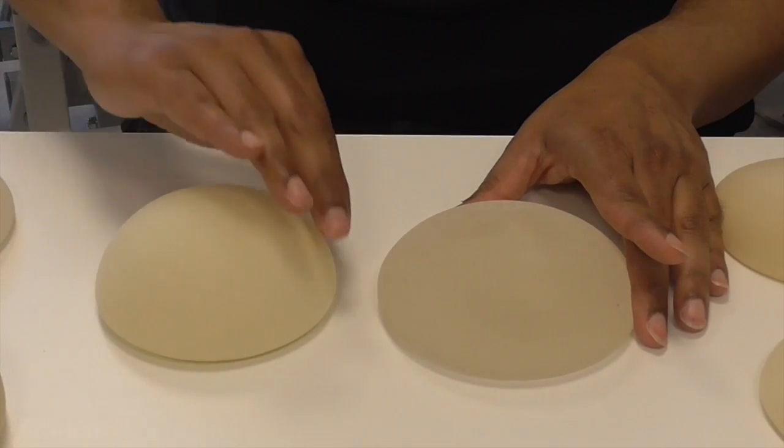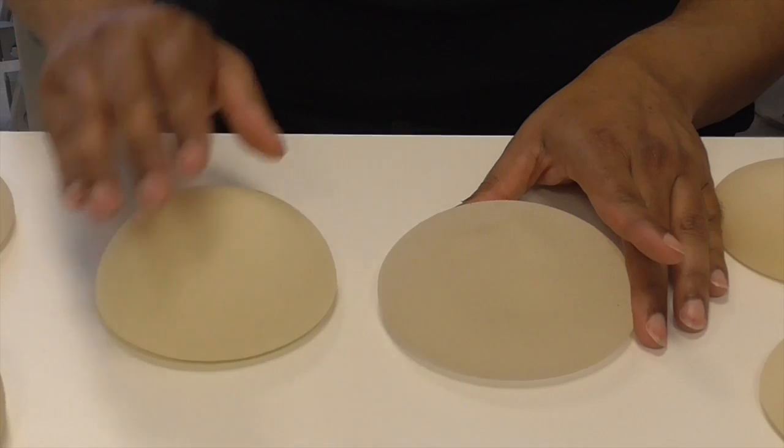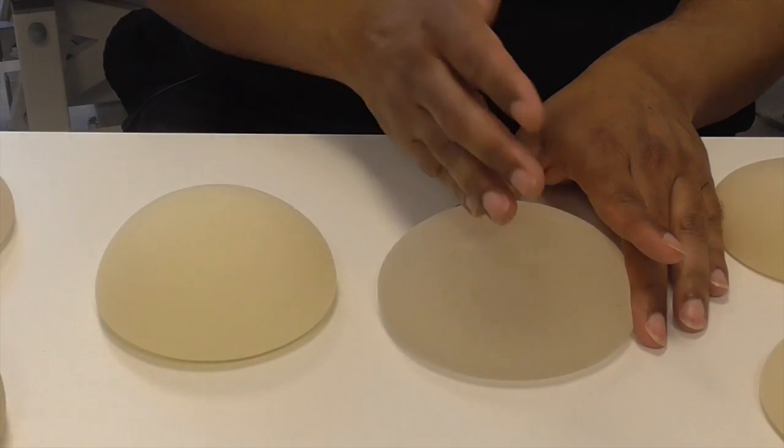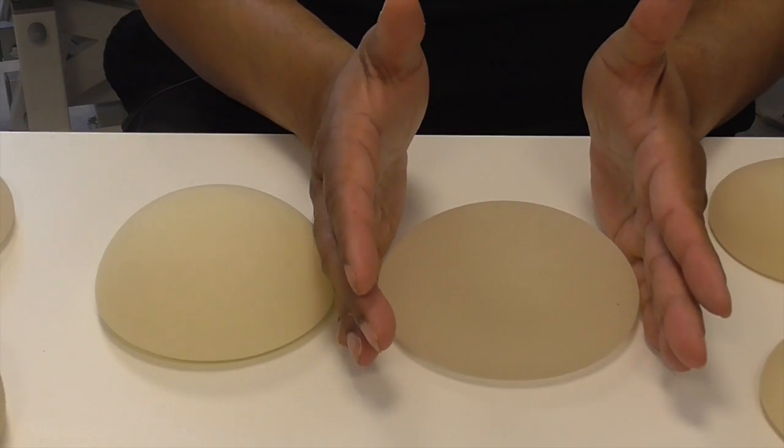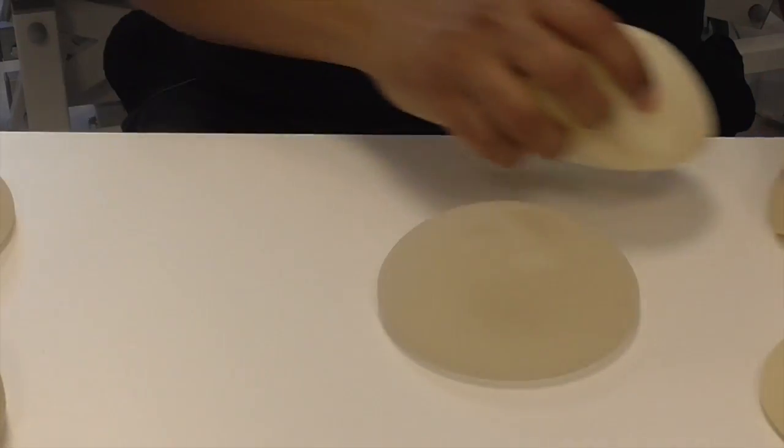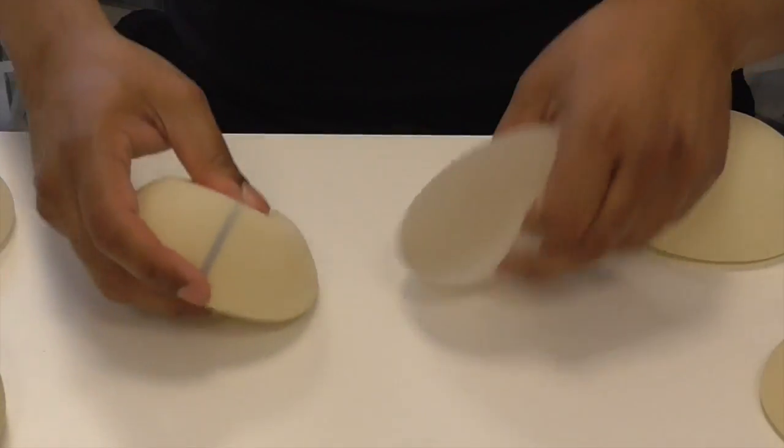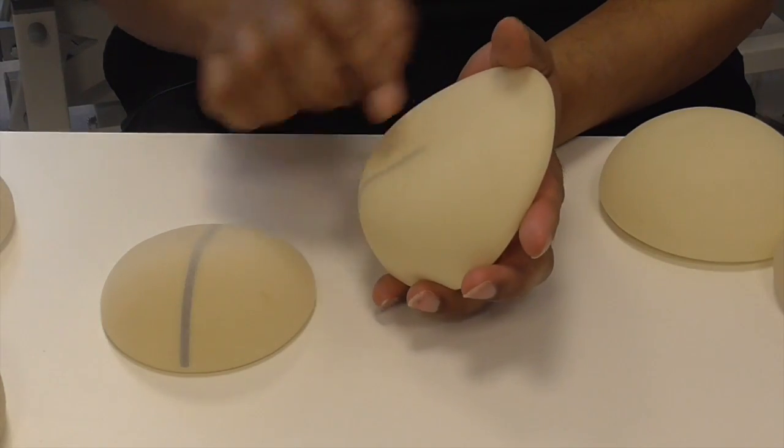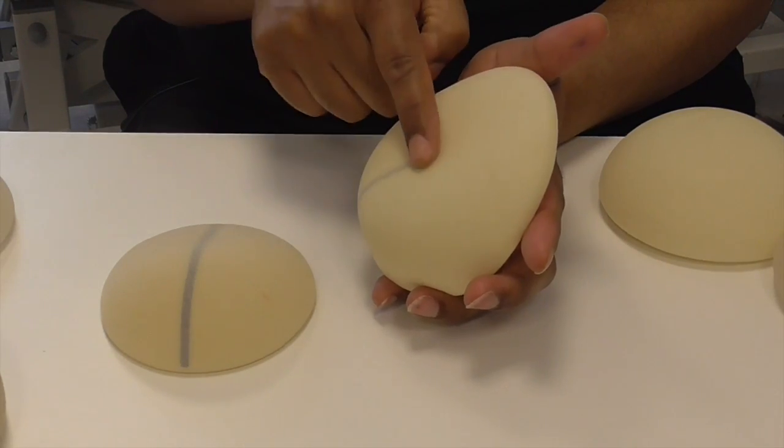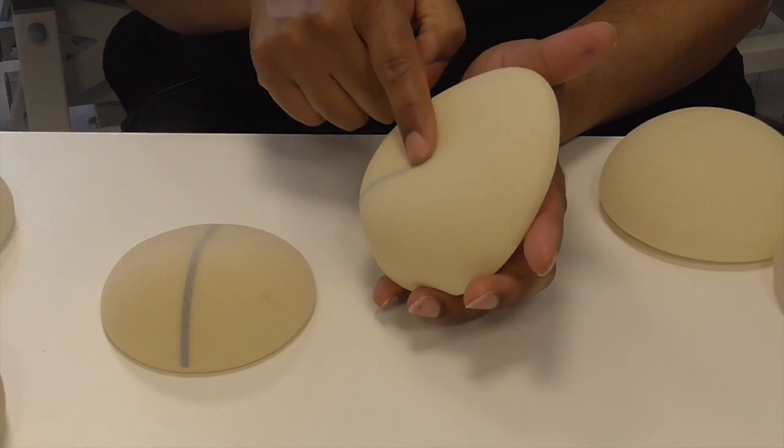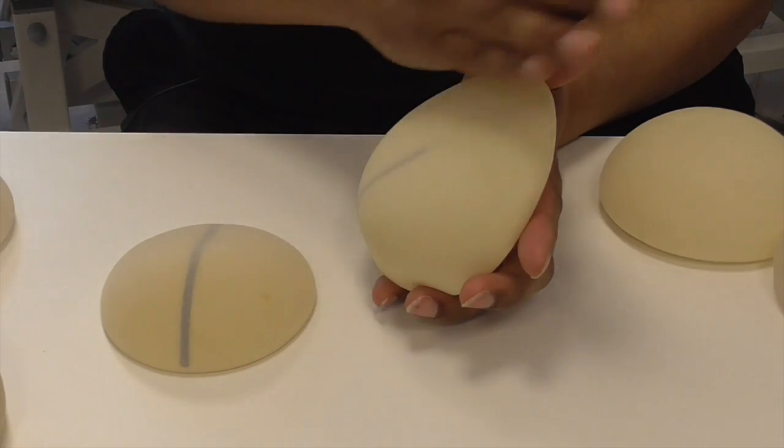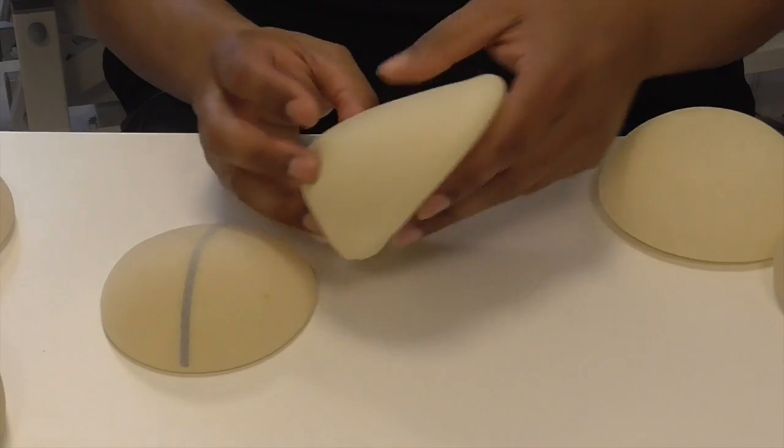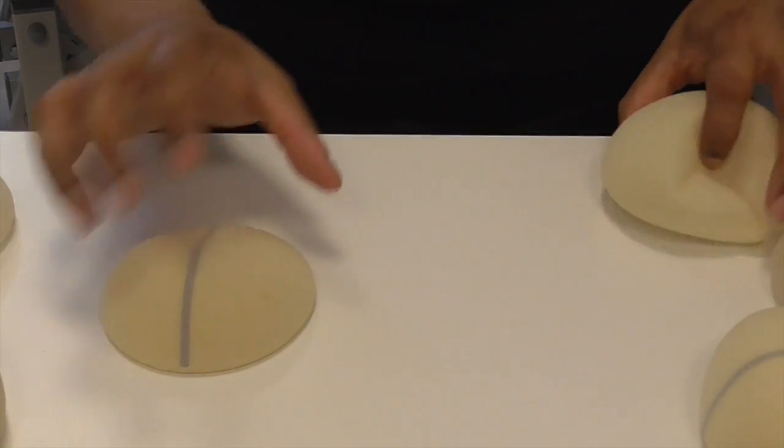You also look at what you call the projection. You've got to make sure that the height is the one you want. They have different varieties of base sizes versus projection. For the anatomical ones, you've got to look at the projection at the lower pole as opposed to how much projection of the upper pole. There's a wide variety of things to choose from.